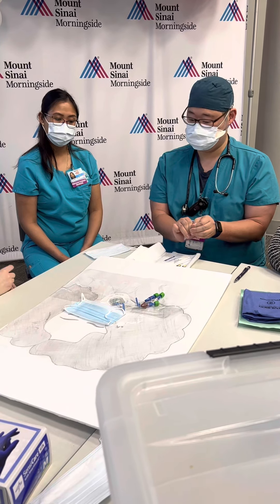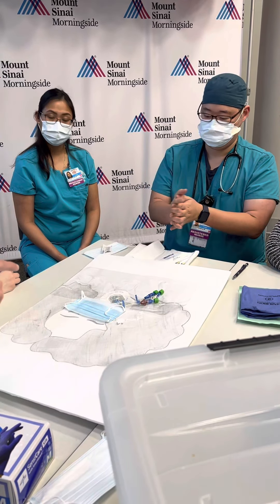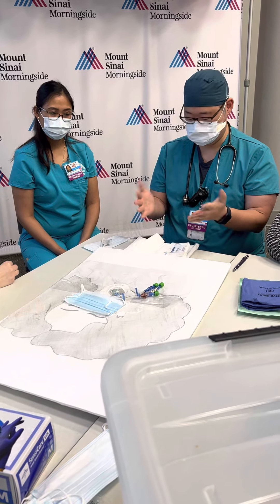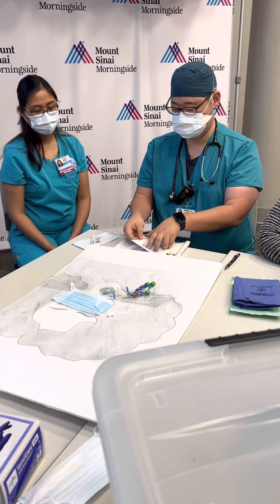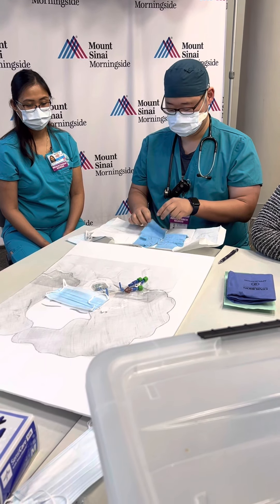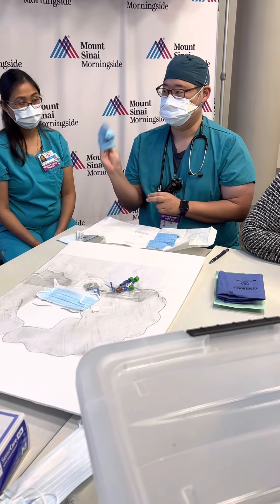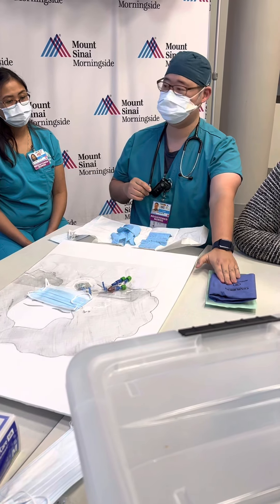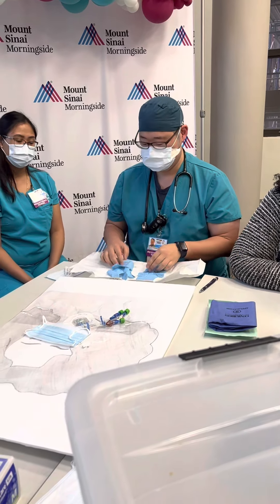So is this first pair of gloves clean or sterile? Clean — we're using these to remove the dirty dressing. Make sure they're dry. Remember, these are not sterile; they just package it like that, so it's a good time to practice your sterile gloves but you don't need to. Last time these didn't fit me, so we brought extra. The cleaning supply has the bigger ones — be conscious of what your size is.